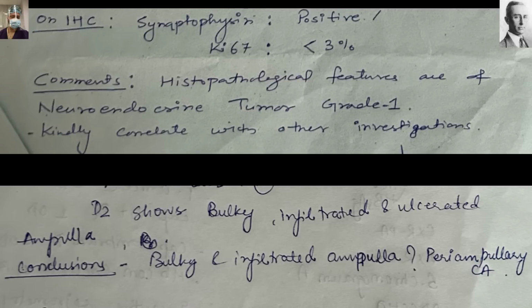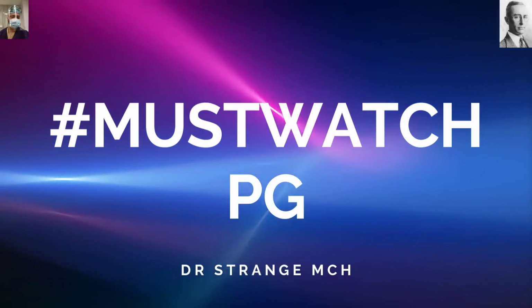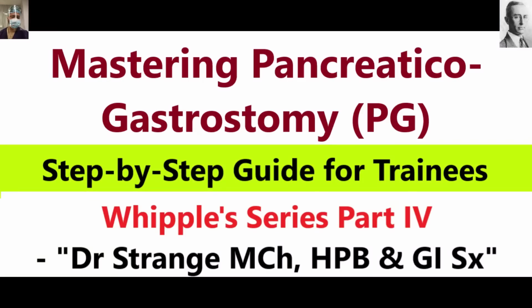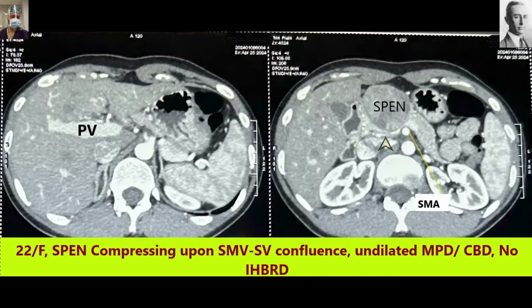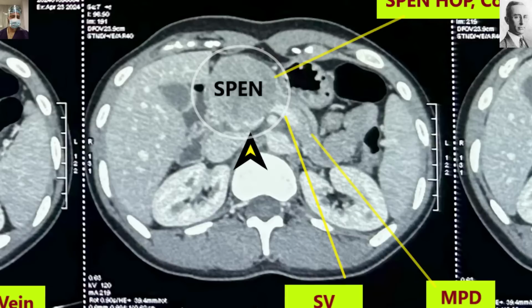In this patient, we did Whipple, and in this particular video, we will showcase the pancreaticojejunostomy in this lady. So friends, as a prequel, all of you can watch our series or a video on the pancreaticogastrostomy so that you have a gradual and better build-up of the knowledge, and you will understand the basic difference in the PG and PJ, which we have discussed in quite a lengthy detail in this video.